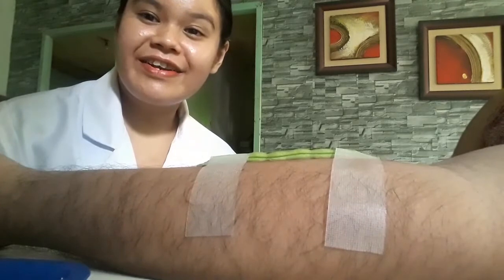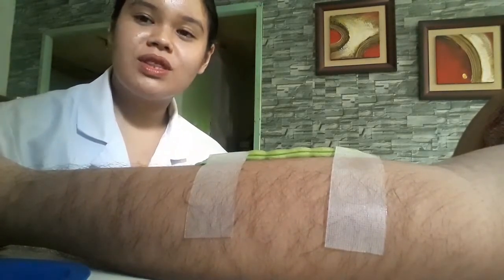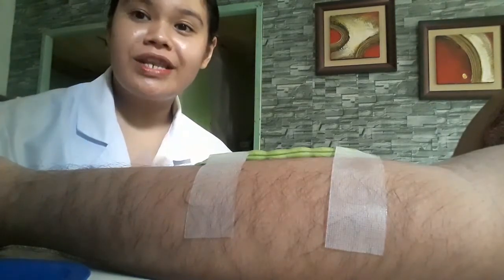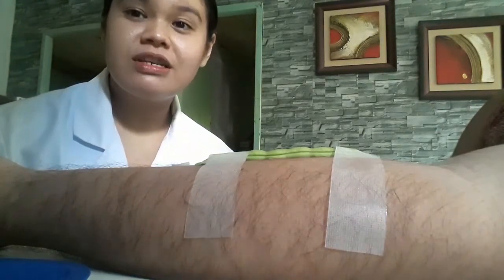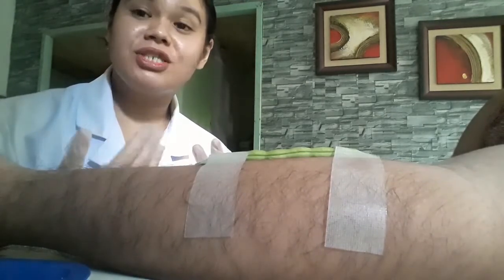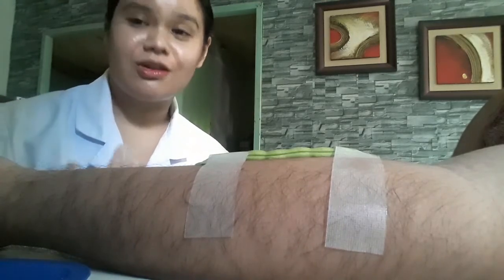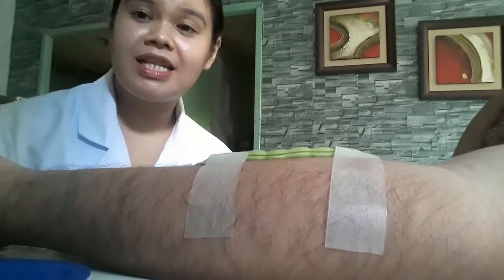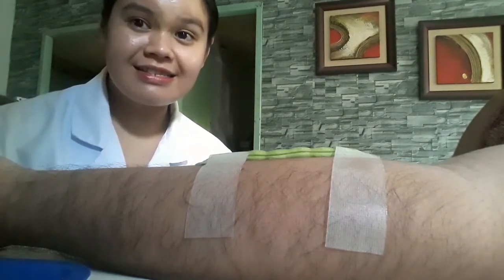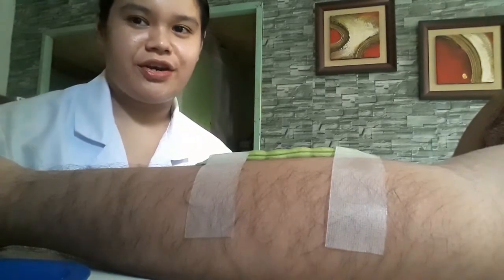Assist the client in a comfortable position and indicate the time when you injected the medication. Also, do not recap the used needle, and discard the syringe, the cotton ball, and the alcohol swab in the appropriate receptacle, and document all the findings, or document all the procedures that we did earlier.